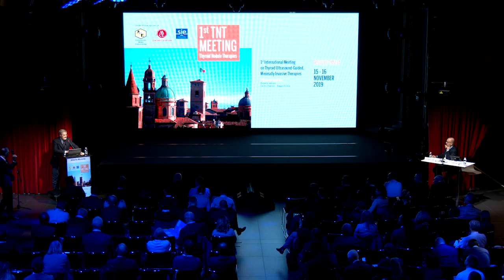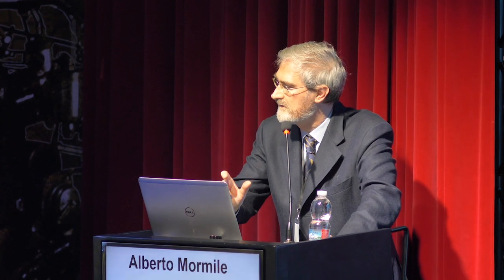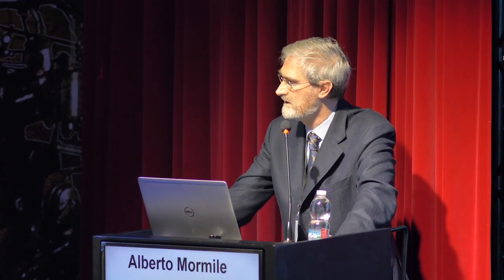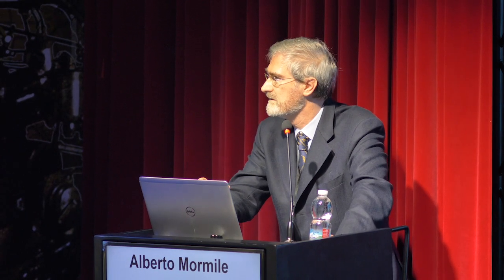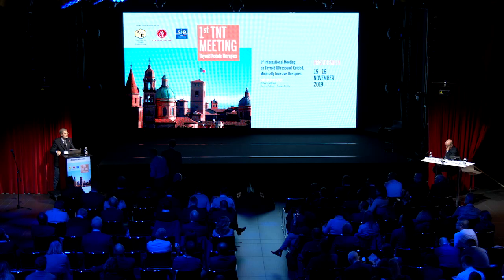I think that in all thermal ablation, laser and radiofrequency, there is an augmentation of the hormone in the circulation. But in our experience, there is no clinical consequence. There is no problem because it lasts during one day only. Yes, also with laser, or I think microwave.